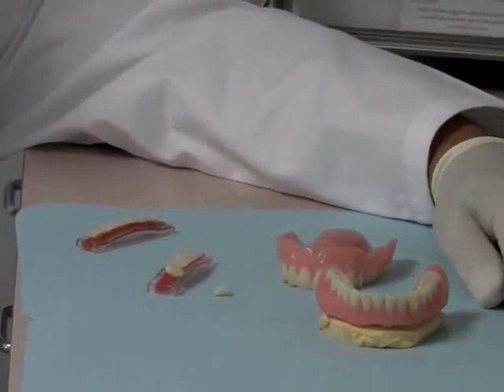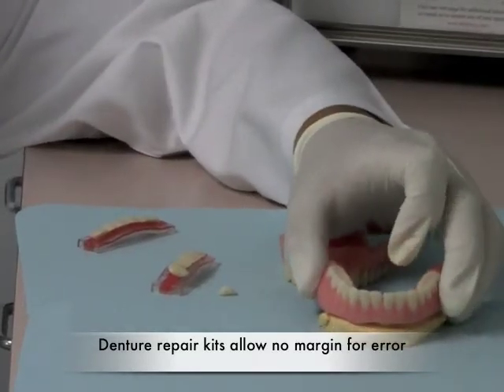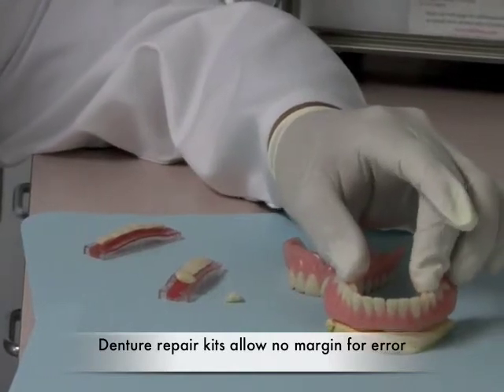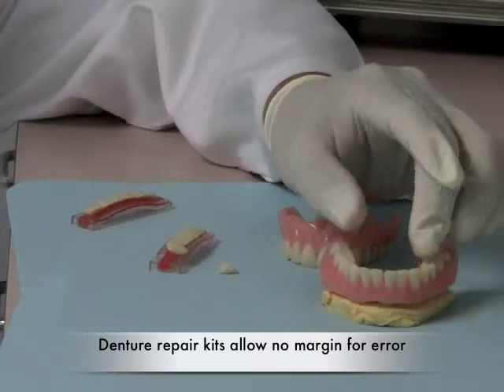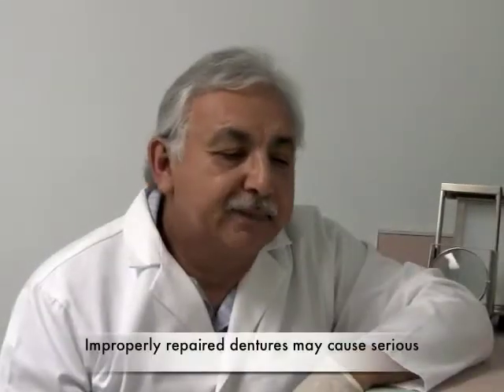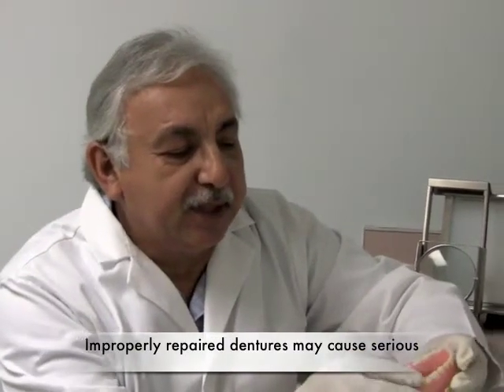If I don't have time and I don't have the materials needed, I will send the denture out to the lab. So the next step is I'm going to show you how I use the acrylic here in the office, and then I will show you how to finish the denture. Remember, this took me years to learn how to do. Okay, next I just want to continue and show you how the denture repair would be done.